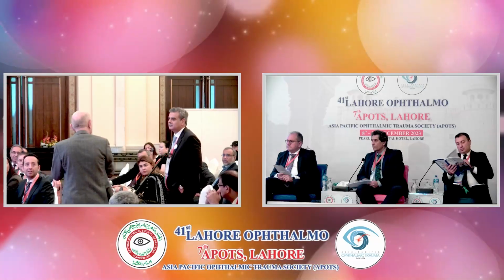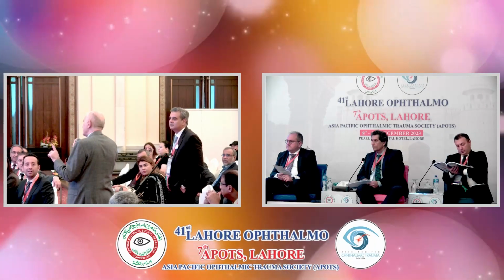My question regards flap displacement. When we use amniotic membrane or a graft, the problem is whether it will displace in time. This is why some people introduce the flap underneath the macular hole edges, and then generally it's tamponated with long-acting gas.